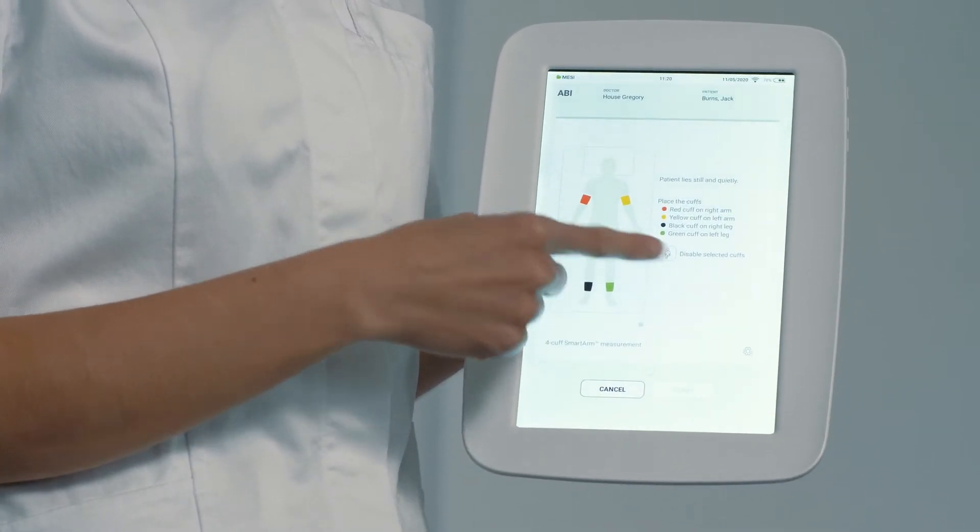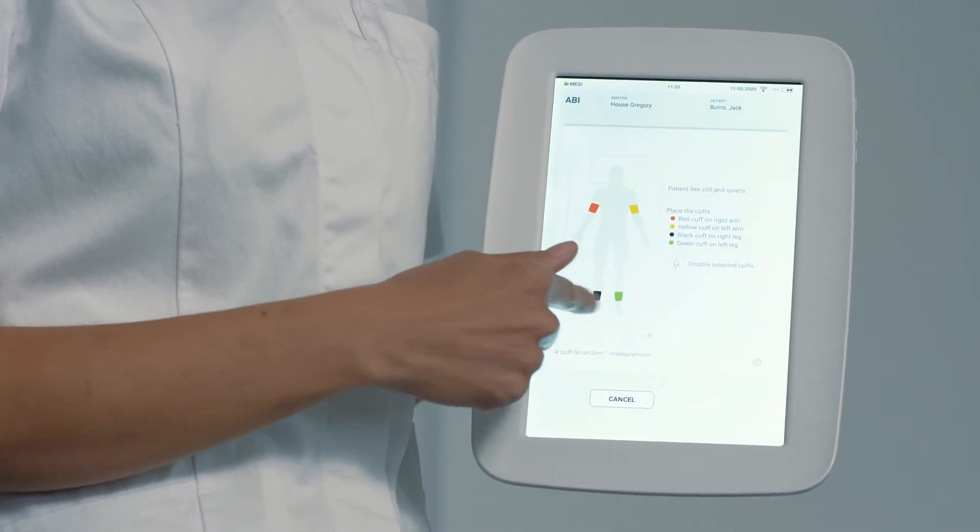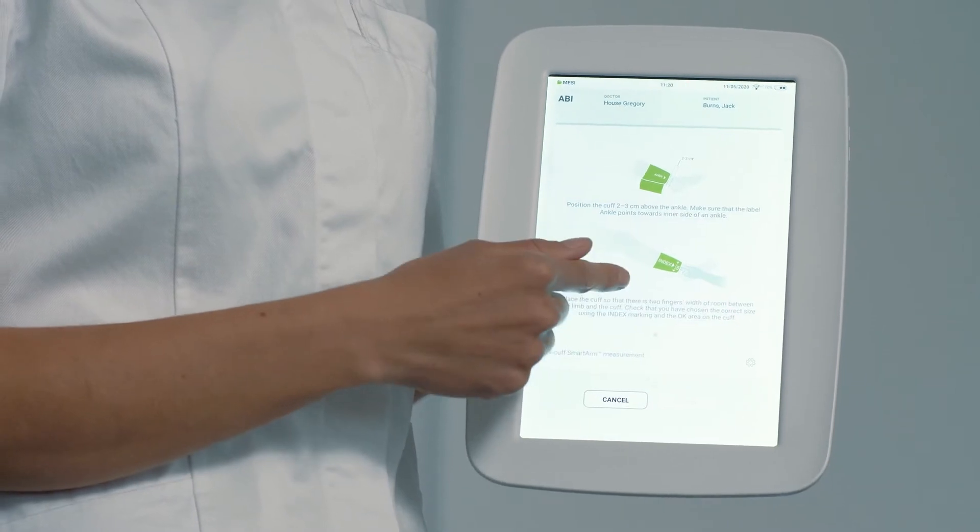The application guides you through the correct cuff placement and it directs you to the guidelines printed on each cuff.